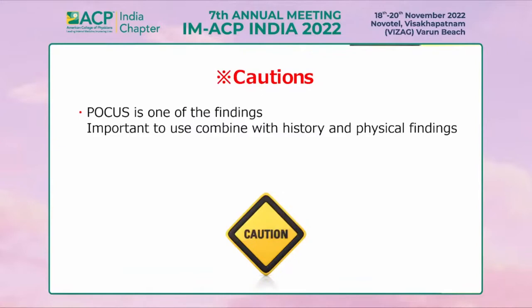There are a few things to keep in mind when doing POCUS. POCUS is one of the findings and it's not a definitive test. It's important to use it combined with history and physical examinations. If the POCUS findings clearly differ from the diagnosis based on the history and physical examinations, consider additional tests. There is no need to stick with POCUS findings.